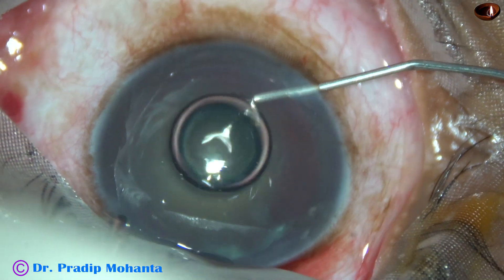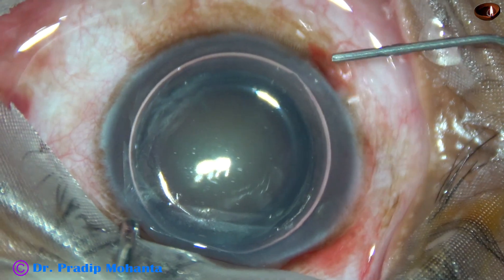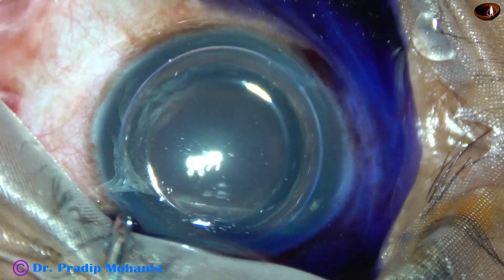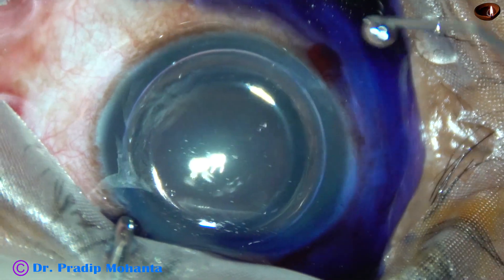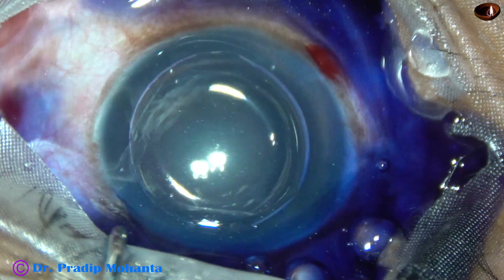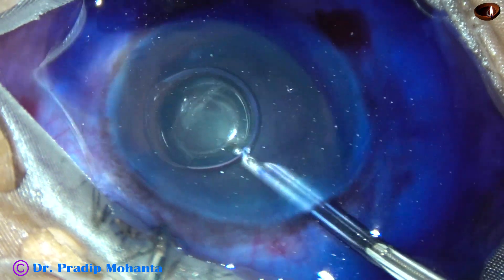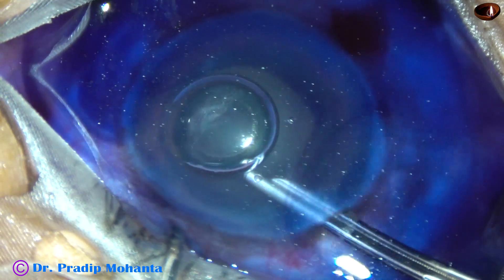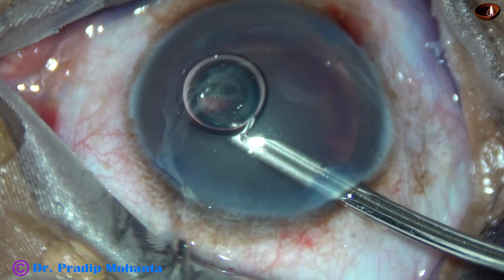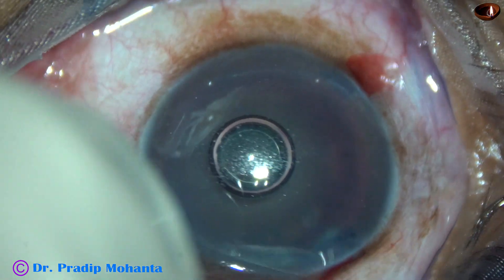Now this is an air bubble. Underneath this air bubble, trypan blue dye is applied over the anterior capsule. Staining becomes immediate if you stain the capsule underneath an air bubble. This is a bit of adrenalin. Because the eye is deep-seated, there is fluid collection over the cornea, and the assistant has to soak the fluid away from the ocular surface.